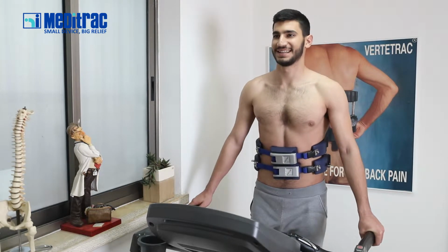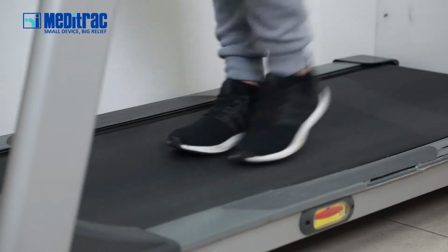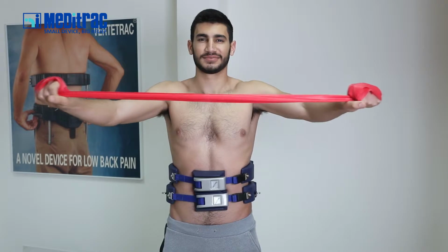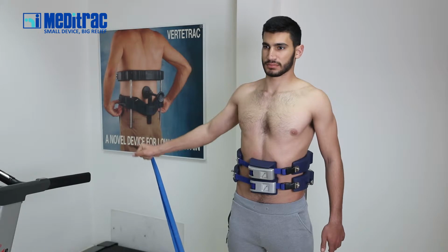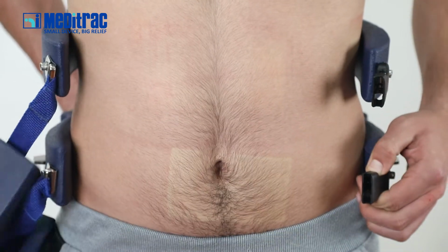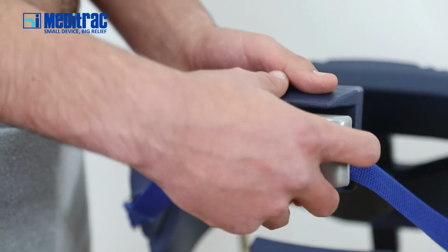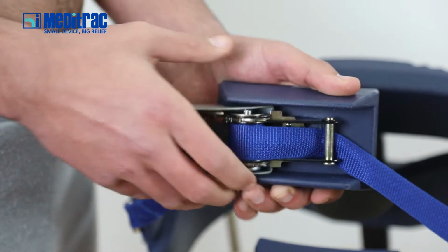It is recommended for the patient to walk freely in the room or participate in active exercises during the treatment session, for example, on a treadmill or using elastic bands. To loosen the belt, pull the ratchet lever as far to the right as possible while lifting the U-shaped retaining clip.